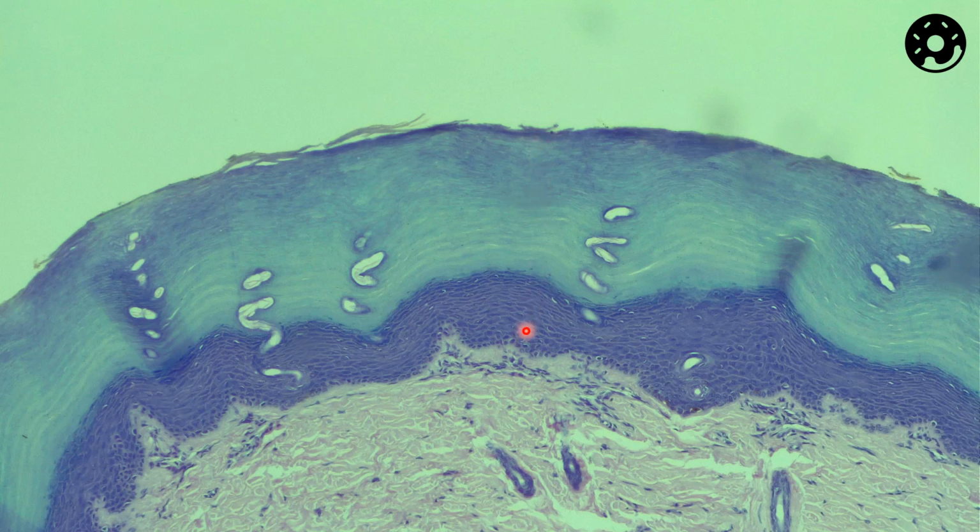So these are the different layers. Stratum Corneum, Stratum Lucidum, very thin, translucent layer we only find in thick skin. Stratum Granulosum, this darker layer where it gets a shade lighter, Stratum Spinosum, and Stratum Basale down at the very bottom. How do I remember this?